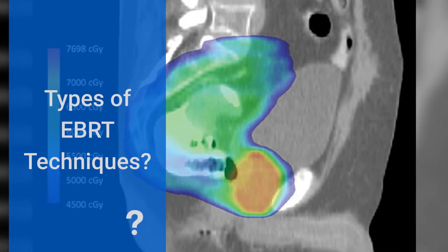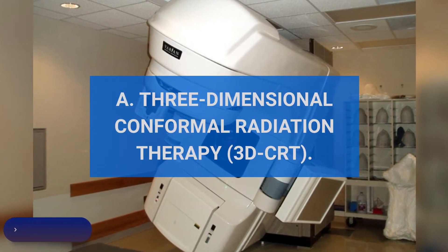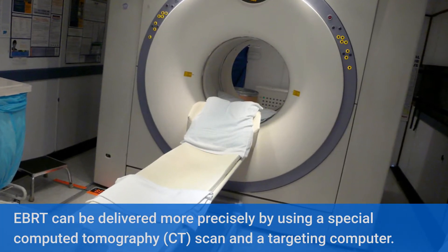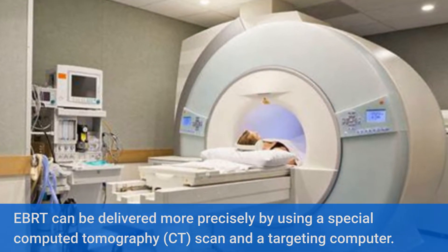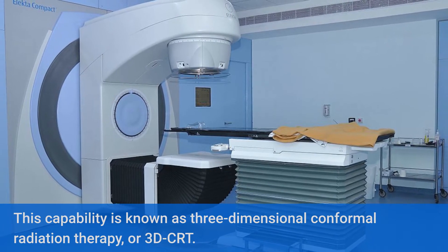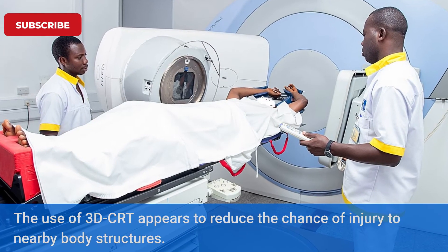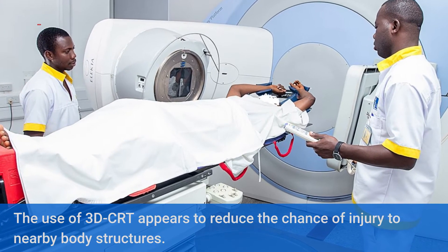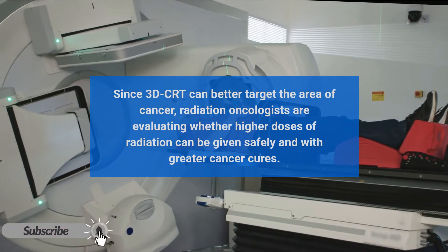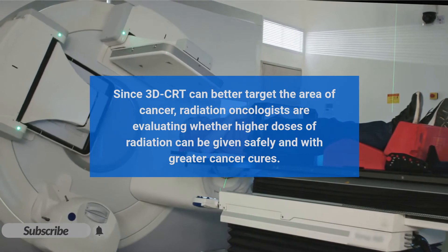Radiation therapy — types of EBRT techniques. 3-Dimensional Conformal Radiation Therapy: EBRT can be delivered more precisely by using a special computed tomography (CT) scan and a targeting computer. This capability is known as 3-Dimensional Conformal Radiation Therapy, or 3DCRT. The use of 3DCRT appears to reduce the chance of injury to nearby body structures. Since 3DCRT can better target the area of cancer, radiation oncologists are evaluating whether higher doses of radiation can be given safely and with greater cancer cures.